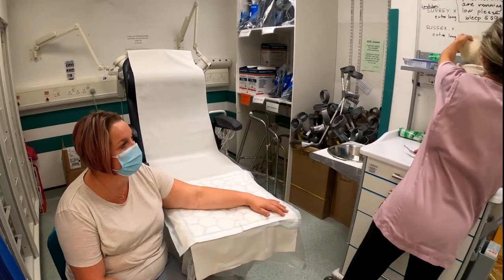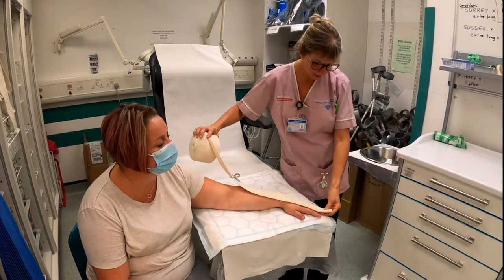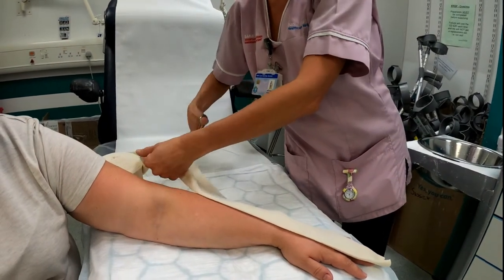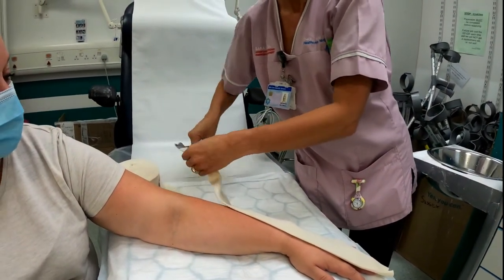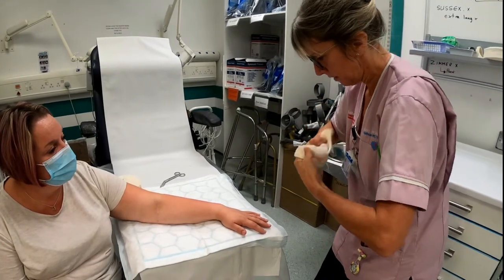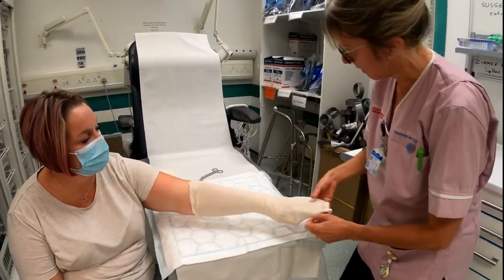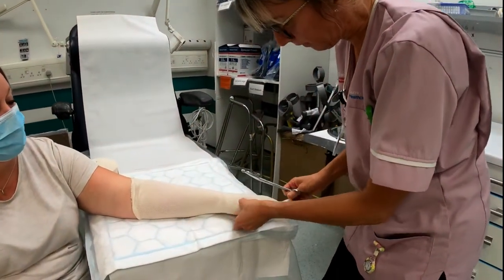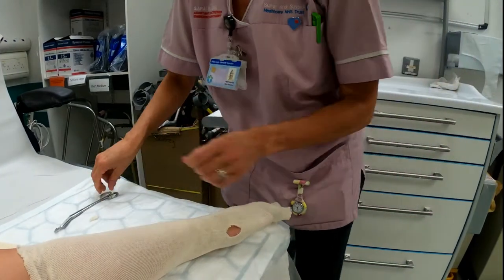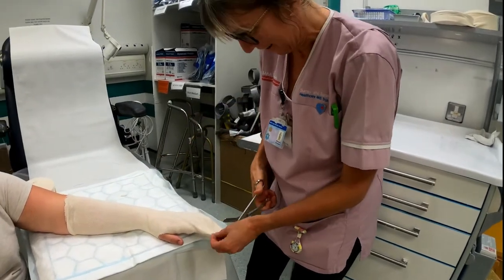We'll get the stocking net and measure from the tips of the fingers to just past the elbow crease — that will give you enough. Put that on, it comes right down to the fingertips, and then at the base of the thumb just put a piece of the sock out and do a little nick for the thumb to go through.